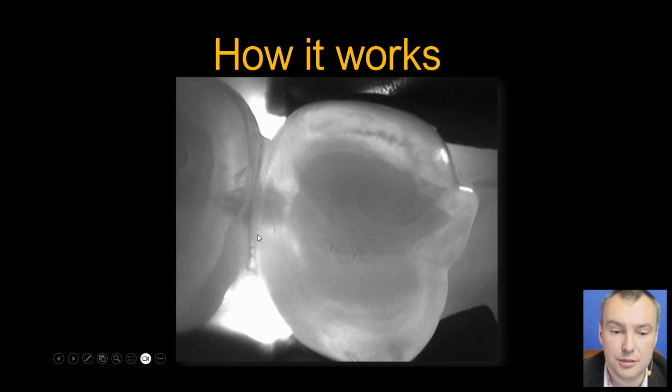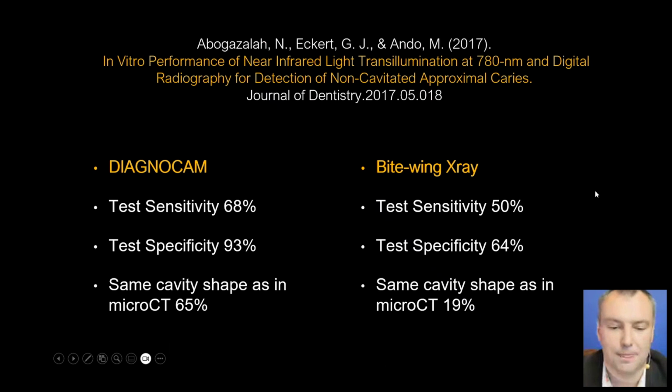And these are the images that we will see when we try to examine every tooth. Those are three different effects. The image from the transillumination mode, as you can see, is black and white, because this is also an infrared camera, which is actually good because it resembles an X-ray image more than a normal one.